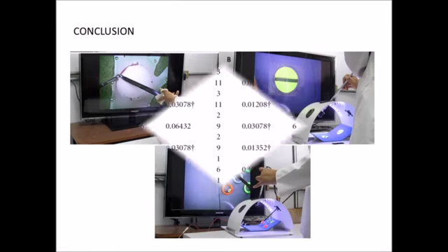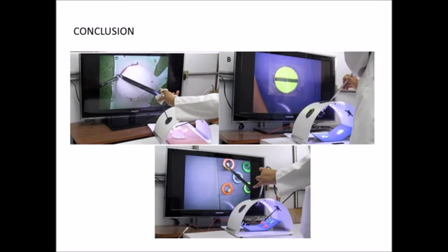In conclusion, working with visual perspectives of 30 degrees requires the development of different visual and spatial abilities, that is, the development of different psychomotor abilities. Our simple and low-cost training system offers the opportunity to develop basic skills across static and dynamic visual perspectives of 30 degrees and the skills required to handle angled laparoscopes. We believe that this will effectively contribute to the development of laparoscopic skills and provide self-assessment in an objective manner without relying on the laparoscopic tower.